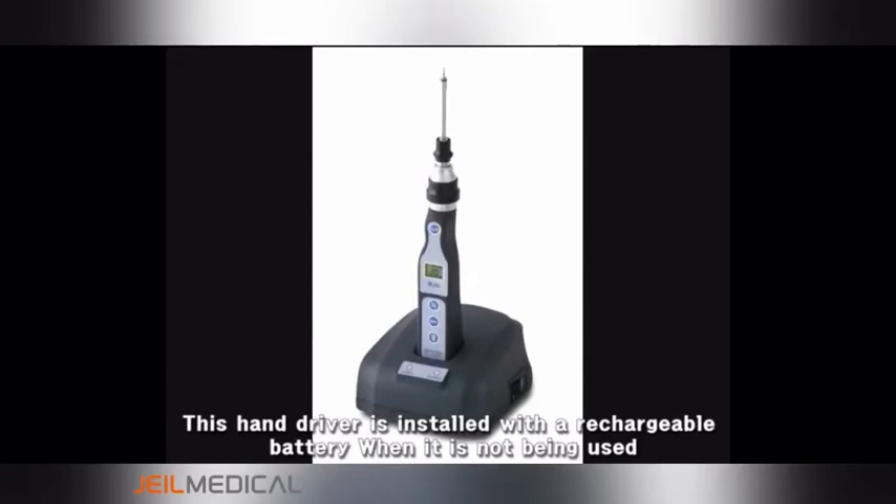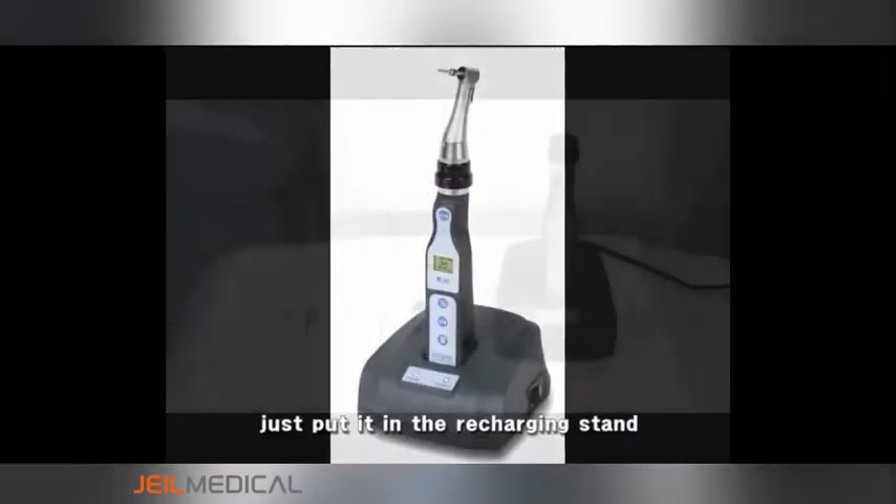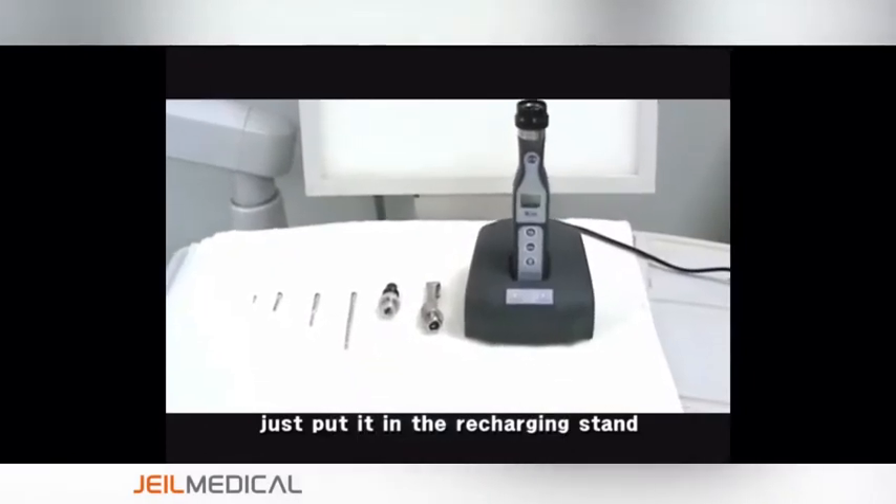This hand driver is installed with a rechargeable battery. When it is not being used, just put it in the recharging stand.